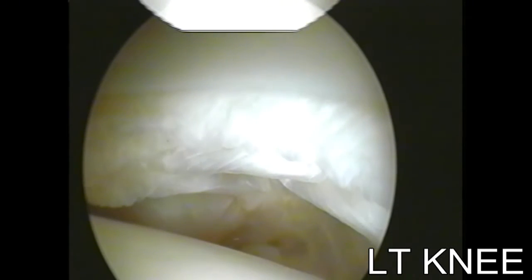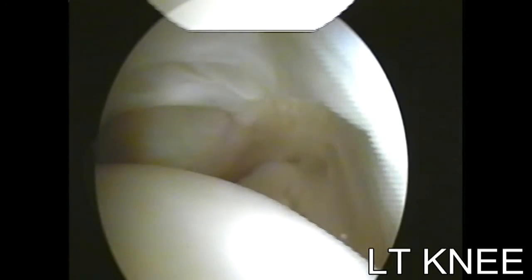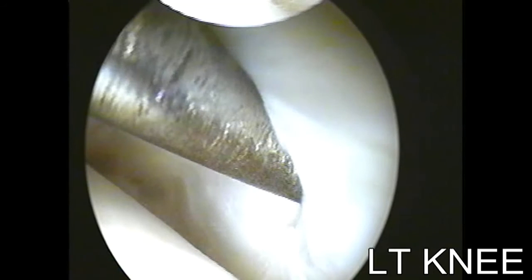The lateral meniscus is elevated with a probe, and the scope is then proceeded gently under the lateral meniscus till the popliteus tendon is identified in the hiatus. The capsule and reinforcing ALL can be assessed anterior to the popliteus tendon. The lateral recess can be inspected. The capsule and the reinforcing ALL tightens with tibial internal rotation.